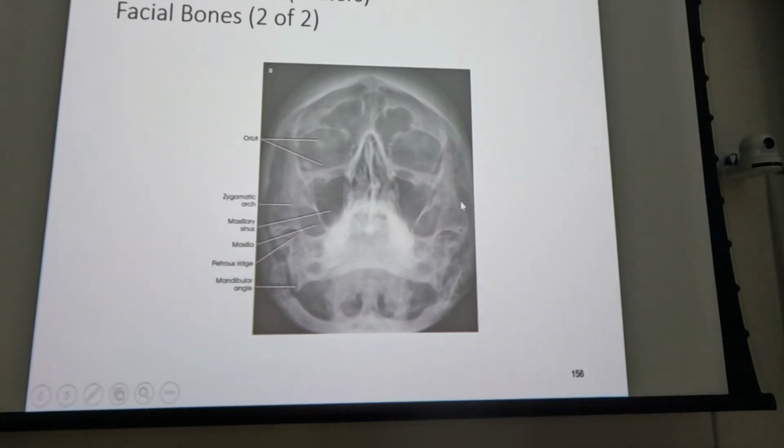Also, and this is not the best image to show this, but follow this, okay? So we've got the lateral wall of the orbit down to this bone right here that kind of reaches back. Now imagine, everybody's done this as a kid, lay on your back, look at the clouds and try to pick out something in the clouds, animals, whatever, right? That's kind of what we're doing here. It's this great, big, flappy looking thing here, the orbit.